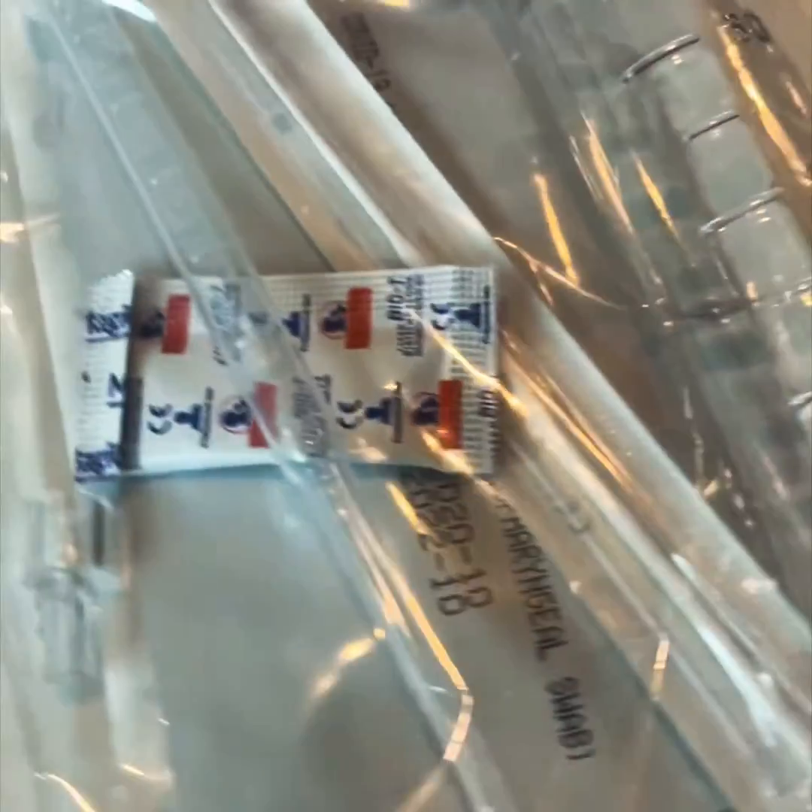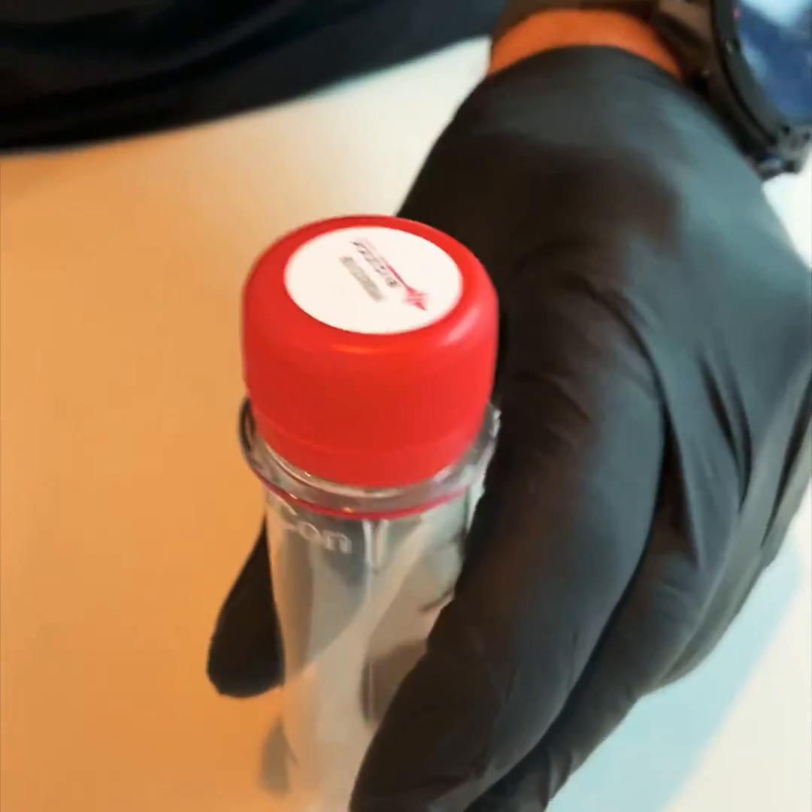However, just for extra peace of mind, I am going to do one of our Biosec antigen cassette tests, which is going to be the gargle. So here's the step-by-step how-to of the Biosec antigen gargle test.